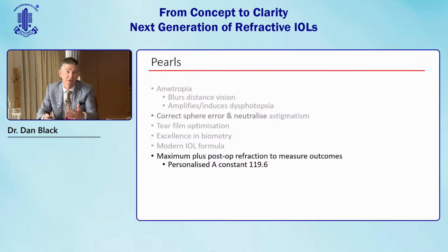in your own patients. To give you one example, when we started doing the proof of concept study, this is a very rigid study and we followed the guidelines to the letter, and we uncovered 1.3 to 1.6 diopters of presbyopia correction. But we went back and retested the patients using a maximum plus technique, and we uncovered an additional 1/3 of a diopter. And so if you're not using a maximum plus refraction, you may well underestimate the final outcome by 1/3 to 1/2 a diopter.